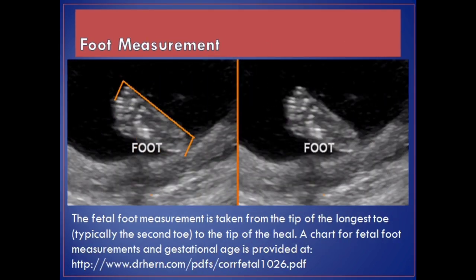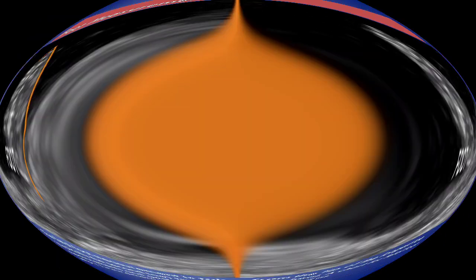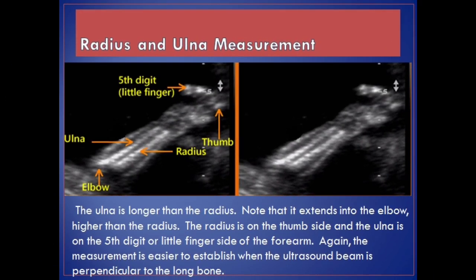Foot measurement. The fetal foot measurement is taken from the tip of the longest toe, typically the second toe, to the tip of the heel. Radius and ulna measurement. The ulna is longer than the radius — it extends into the elbow higher than the radius. The radius is on the thumb side and the ulna is on the fifth digit or little finger side of the forearm. The measurement is easier to establish when the ultrasound beam is perpendicular to the long bone.